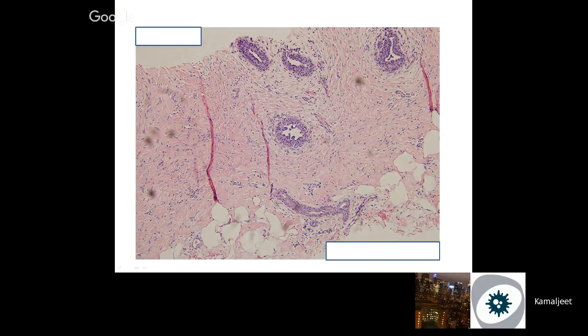The nuclei get smaller as you go into the lumen. The nuclei at the base are broad, and the nuclei also get smaller as you get into the lumen. And many nuclei, you'll see, are sort of lying flat, parallel to the basement membrane. That you also see in this gynecomastoid UDH. At the same time, you'll also see this patch-like, very cellular proliferation in the stroma. So overall changes in the stroma and the duct make it gynecomastoid, or gynecomastia, or gynecomastoid hyperplasia in a female breast.